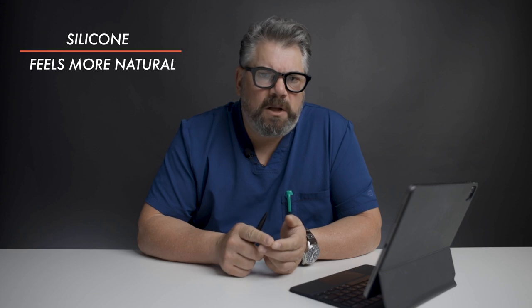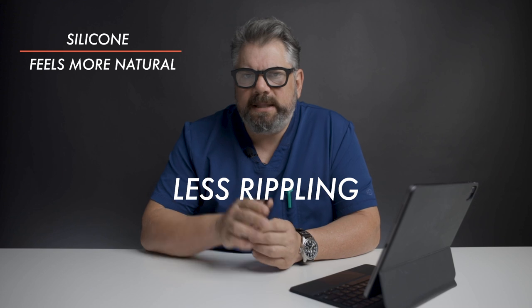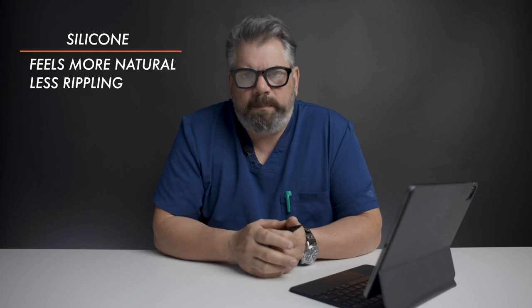The second reason I prefer silicone implants over saline implants is that there's less rippling. Rippling refers to those little curves that you can get after you have your implant in for a while, and it's less with a silicone implant.